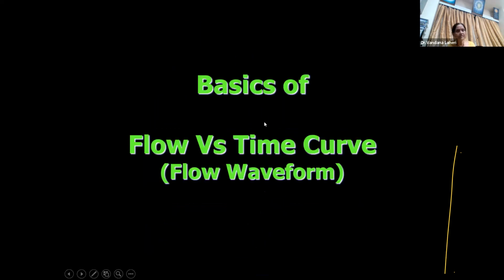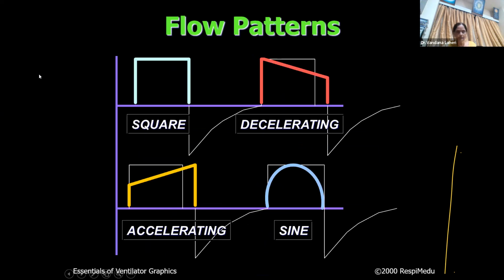Now let us see the basis of a flow versus time curve. We all know that some ventilators provide you flow patterns: square wave flow pattern, decelerating flow pattern, accelerating flow pattern, and a sine wave flow pattern. But today's graphics, whatever I discuss, we will be completely seeing all the waveforms with a square wave flow pattern. Okay, so please keep in mind whatever I'm showing, it is a square wave flow pattern.